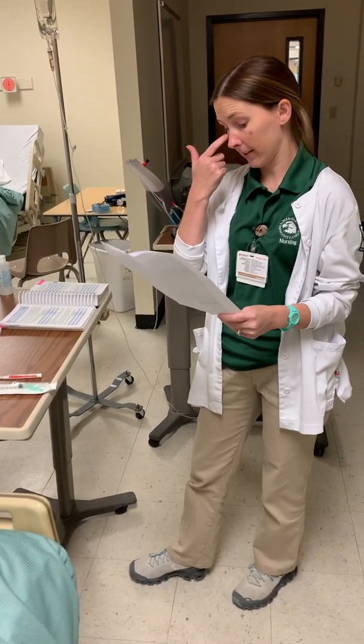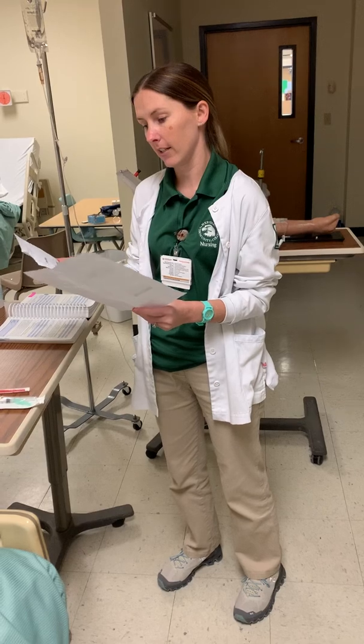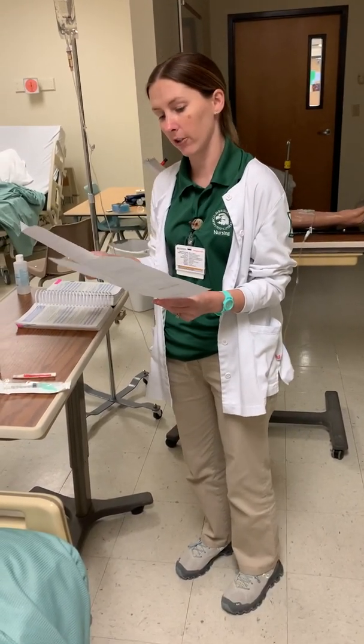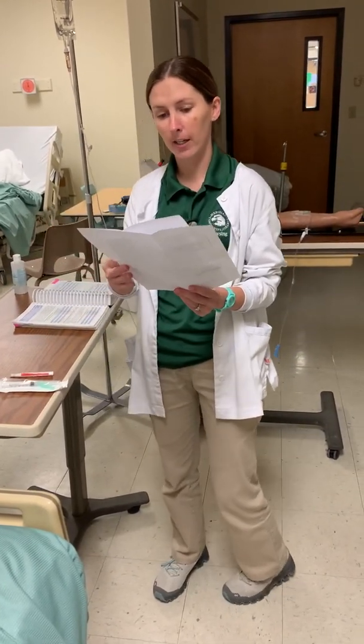It can be given diluted or undiluted. We're going to be giving it over 5 minutes. I'm just going to be checking to make sure my patient doesn't have any allergies, and my patient doesn't have any allergies. And while I have this in my hand, I'm going to go ahead and pick up my medication and compare my medication to my MAR.